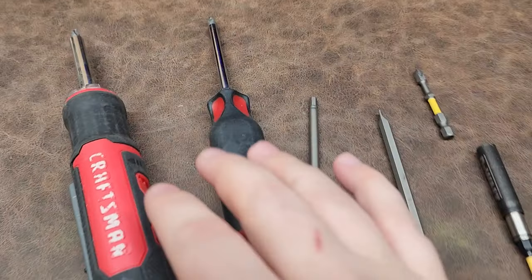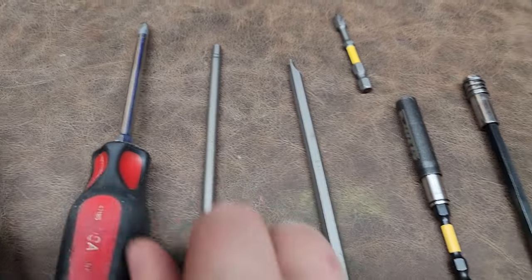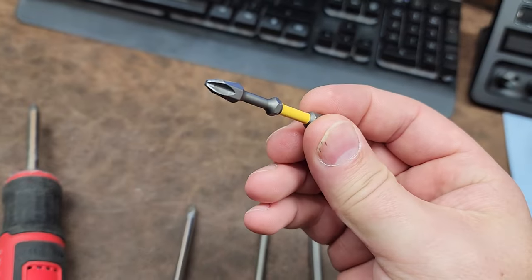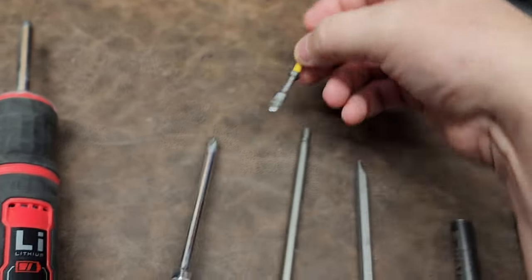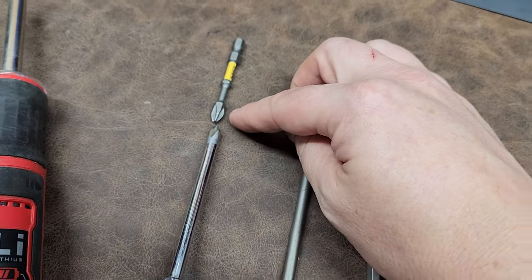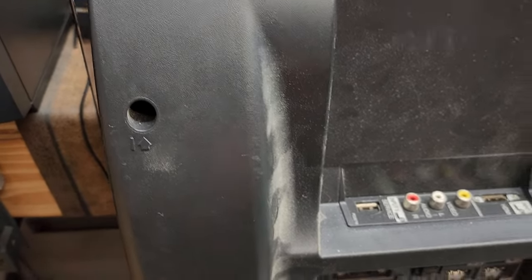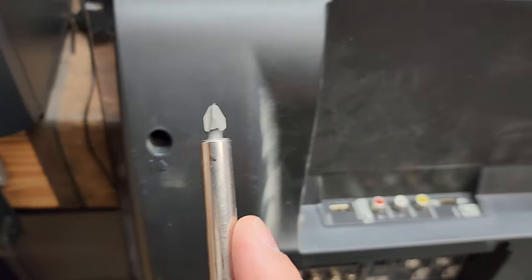The real problem is that screwdrivers are designed for a purpose — they have a very specific diameter based on the size of the tip, and everything else is larger. Take a look: this is an ideal number two Phillips. What we normally have is a hex bit that's been machined down, and it looks slender but it's not even comparable. Since it's non-round, it will damage a lot of plastics. A lot of holes in devices — especially medical devices — are tapered and go all the way down to a perfect fit for the screw head, and as you try to fit this in there, it damages the surrounding plastic. These screwdrivers won't even go in all the way.